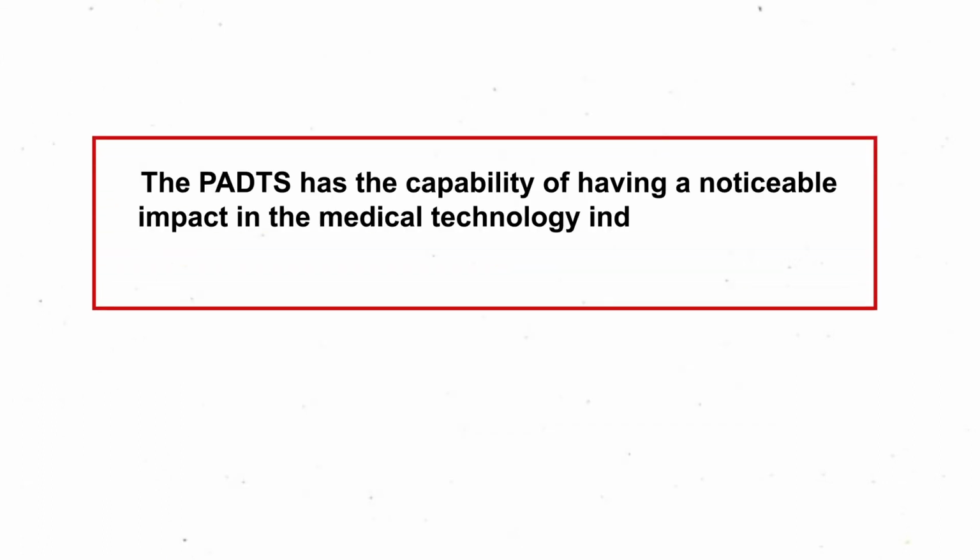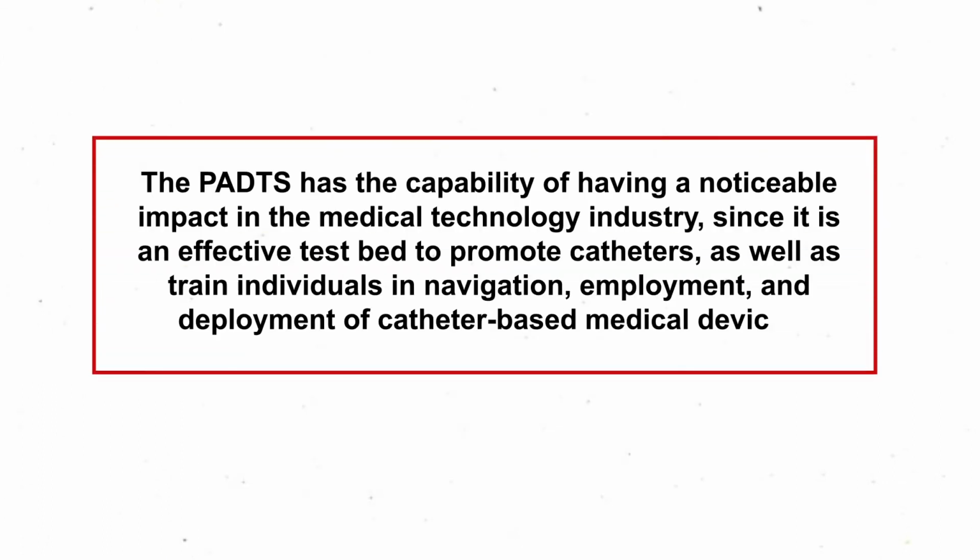The PADTS has the capability of having a noticeable impact in the medical technology industry, since it is an effective testbed to promote catheters as well as to train individuals in navigation, employment, and deployment of catheter-based medical devices.